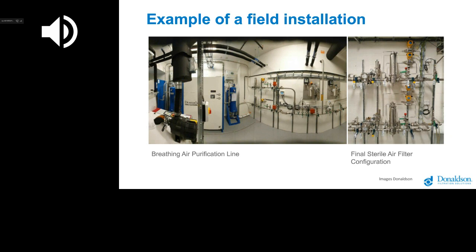Just following on from Wolfgang's presentation, we actually have pictures of the example that Wolfgang spoke about earlier, where we have installed the 3 systems, which give a situation of lead, standby, and spare capacity.